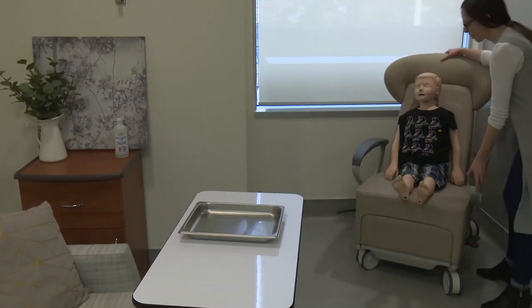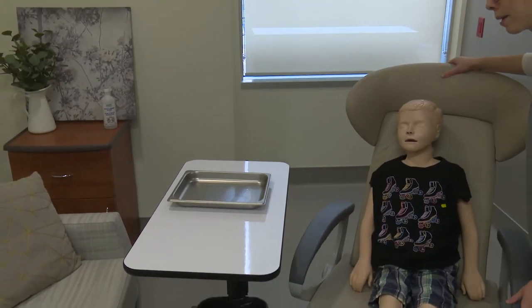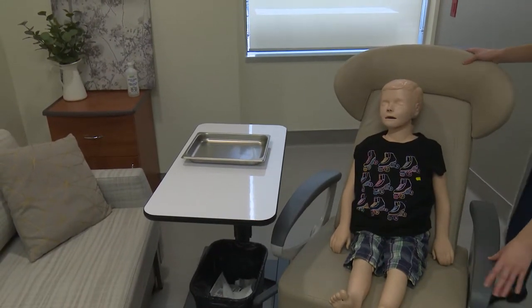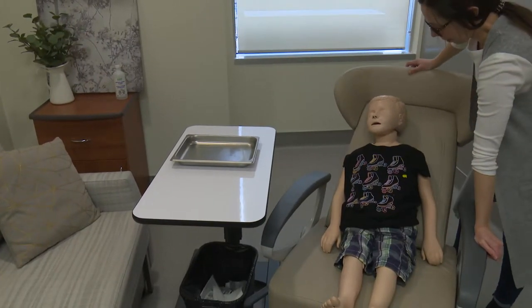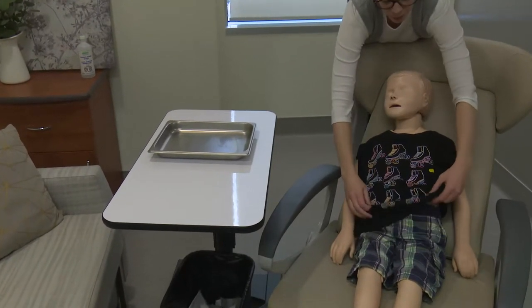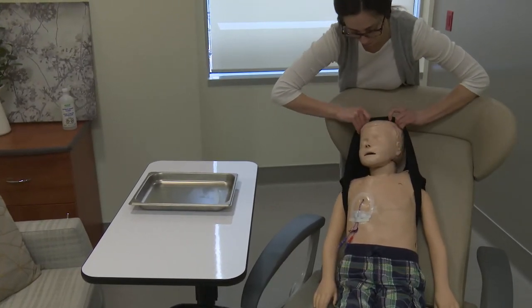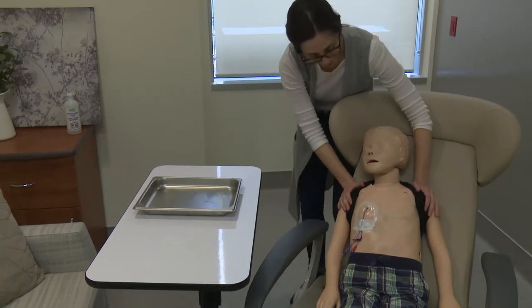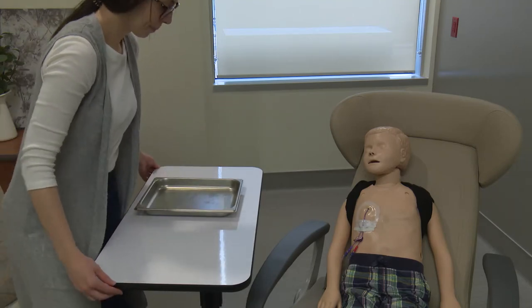While your work surface is drying, have your child expose their line where you will be performing care and help them get comfortable. It is now time to gather and prepare all your supplies for your central line care. See our instructional videos on heparin locking, cap changing, or dressing changes for more information.